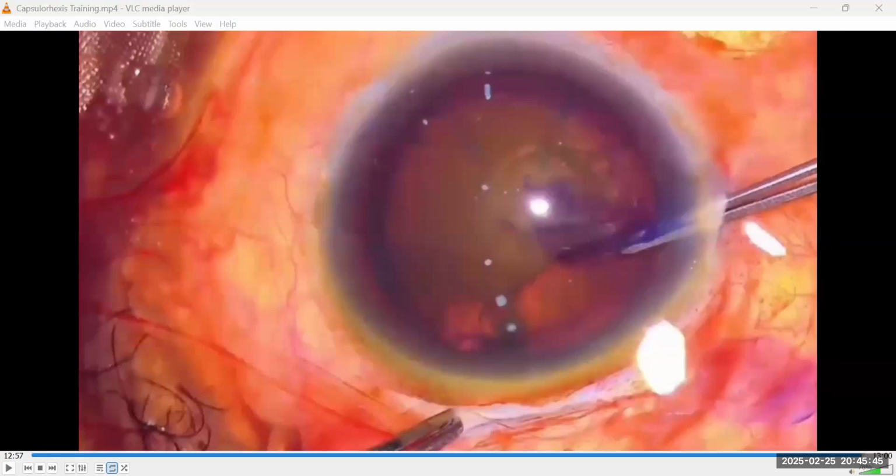Like I said, if the calcification is a smaller area and I can release it with a centripetal pull, maybe the person is asking if there can be any circumferential pull. I'm not sure any surgeon will advise you on that. It depends on what you are seeing, but calcification is just difficult to shear. So you just pull to the center and it tears off.